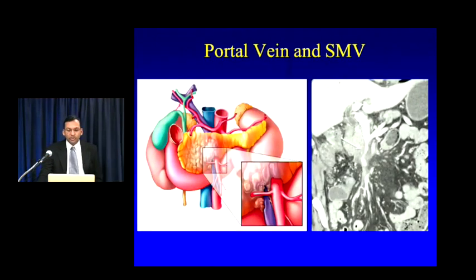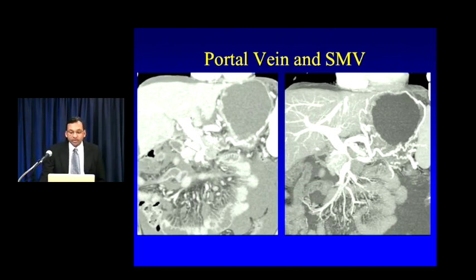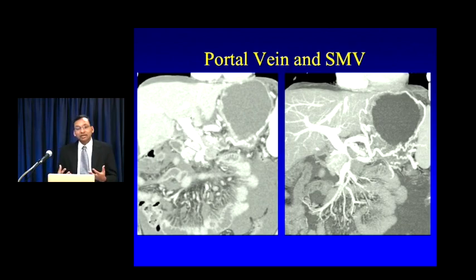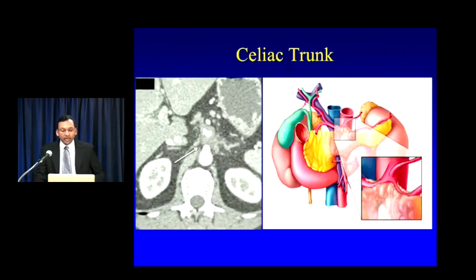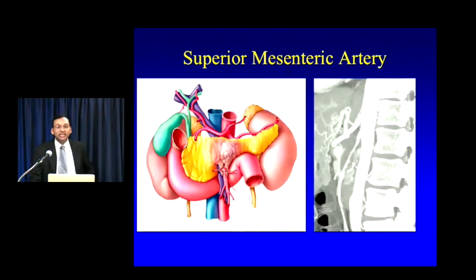Here's an example of significant venous involvement — a three to four centimeter segment of the SMV narrowed all the way to the portal-SMV confluence. Another example shows a hypodense tumor in the pancreatic head and neck with significant stenosis of the distal main portal vein, confluence, and superior SMV. Give a verbal description and let the surgeon decide resectability. For arterial involvement, be more exact — here's a patient with 360-degree encasement of the celiac artery and involvement of the hepatic artery; another example shows 360-degree encasement of the SMA over a long segment with attenuation and narrowing. Virtually no surgeon will operate on a patient with 360-degree SMA involvement.